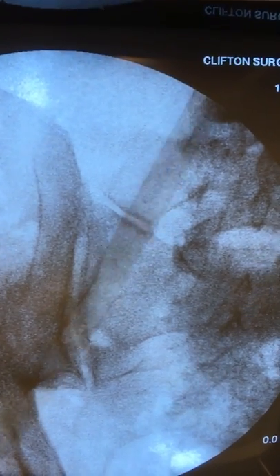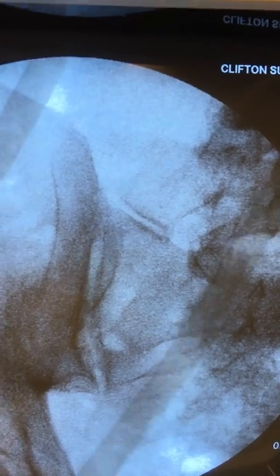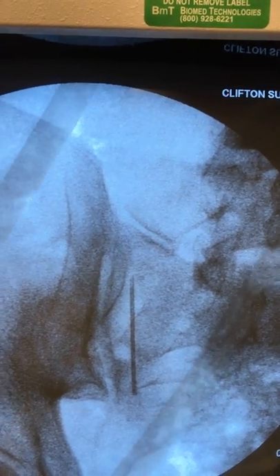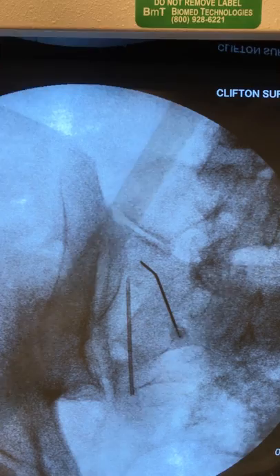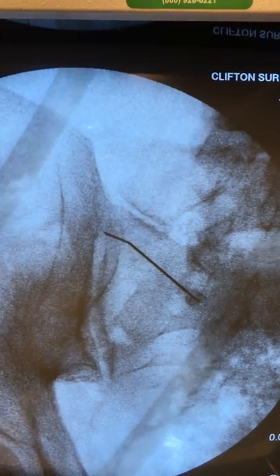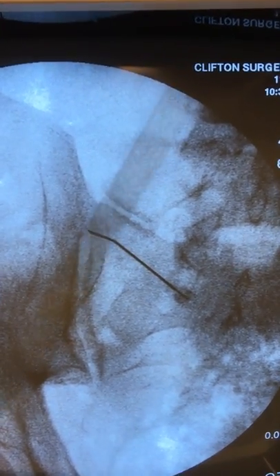This is a sacroiliac joint injection. Sacroiliac joint pain is a very commonly missed condition for low back pain. It is innervated from the S1 through the S4 levels, although in my practice I found that the S1, S2, and S3 are the most common levels involved in pain.